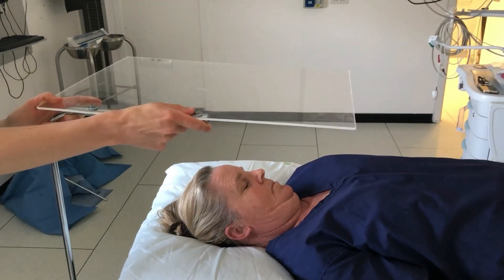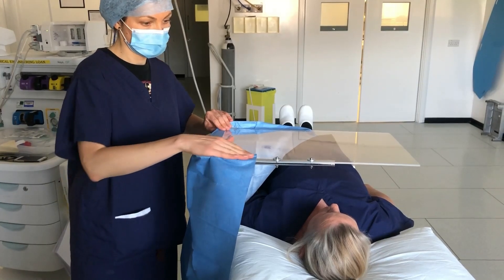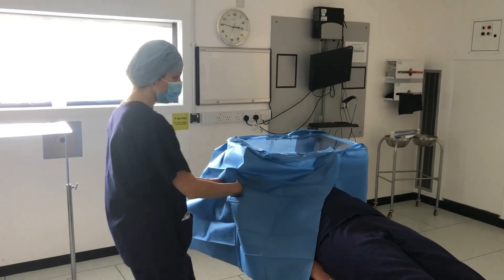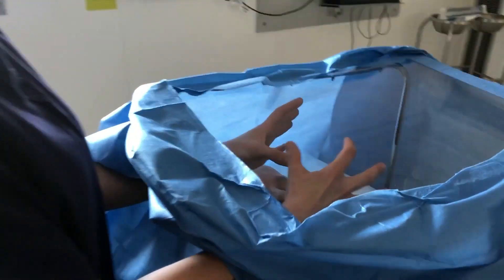The drapes are attached to the perspex table and ideally taped to the operating table, creating an operating chamber. When cutting the slits for your hands, ensure a distance that will allow a good range of movement and a seal around the arms.